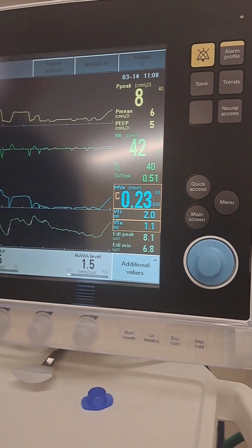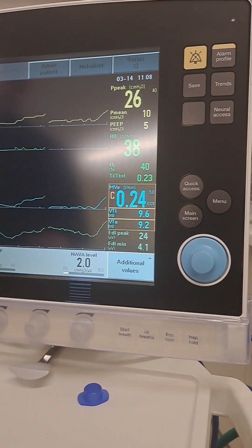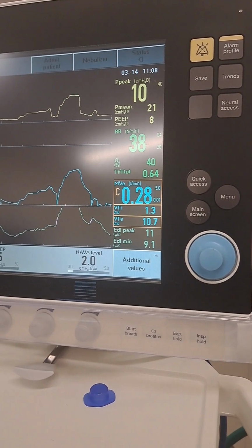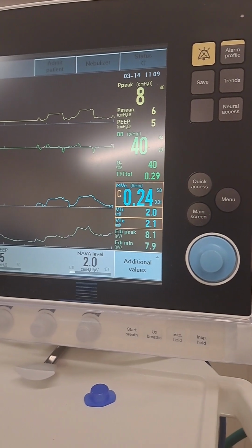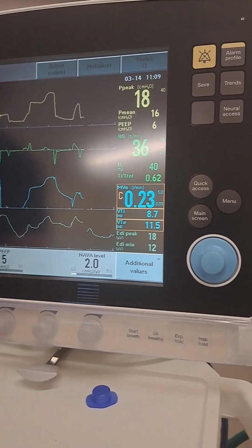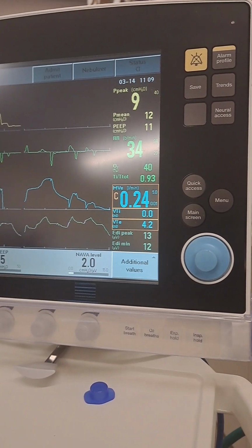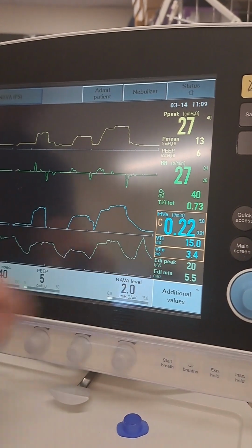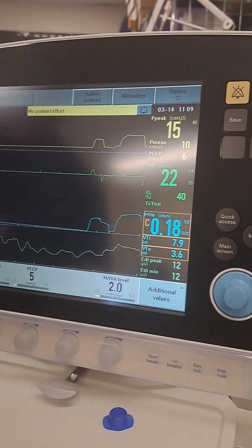What you don't want is, and here's an example. Let's say we put a kid on, we're on a NAVA level of 2.0, right? The kid's been on for a little while, and he's getting used to the vent. This is why I say you wait and see where they chill out at. He realizes, oh, this is great. Now he relaxes. My EDI peak, when we adjusted it to 2, my EDI peaks were 12, 13, 10, 12, in a good range. Now that the kid's relaxed a little bit, now my EDI peak is 5, 6, 4, 5, 6.